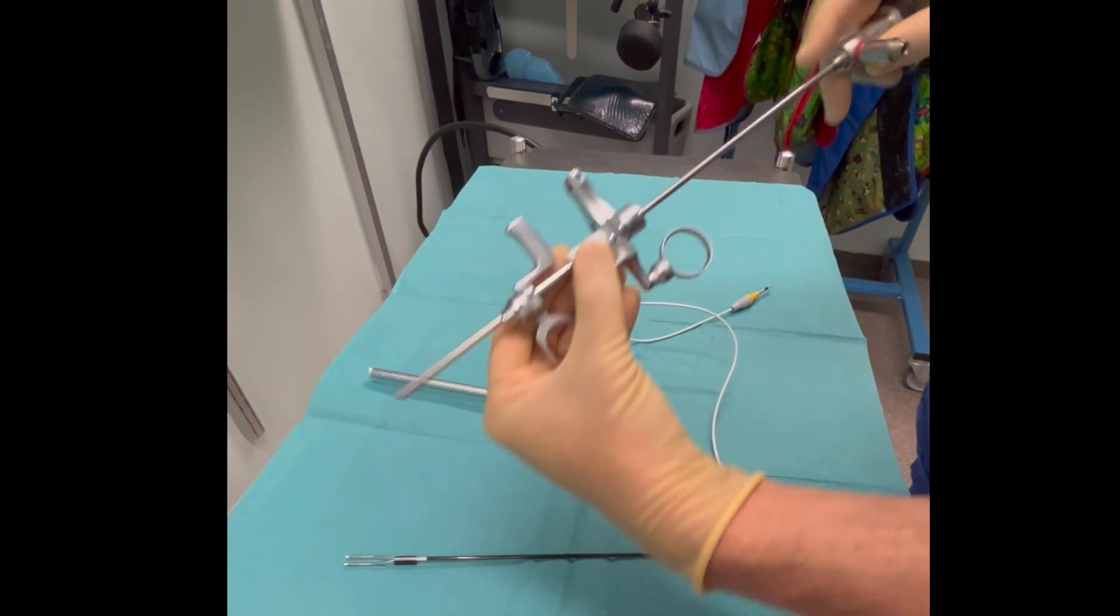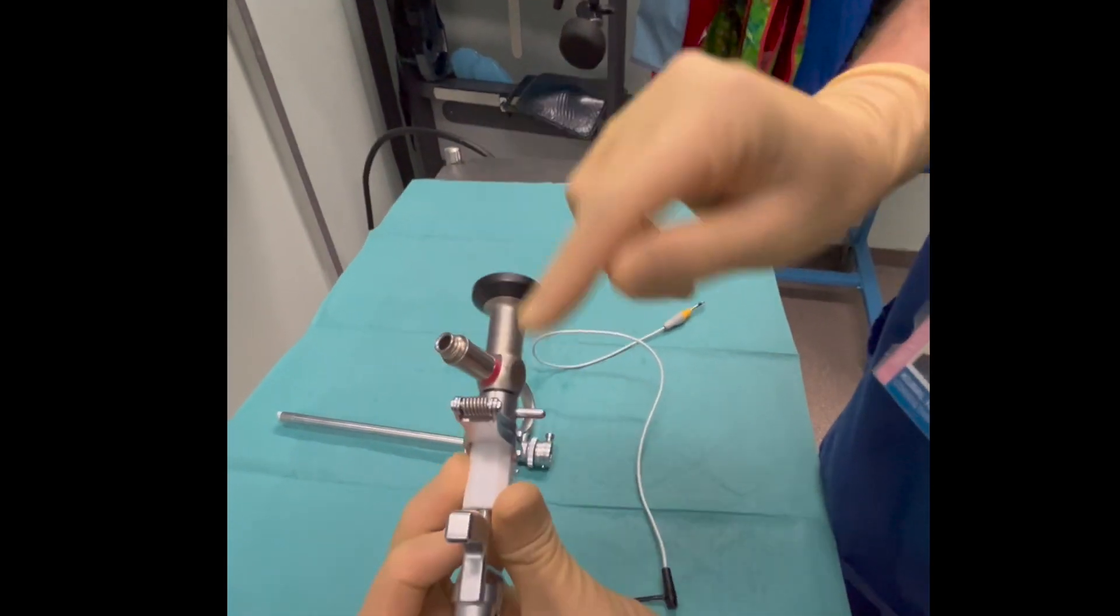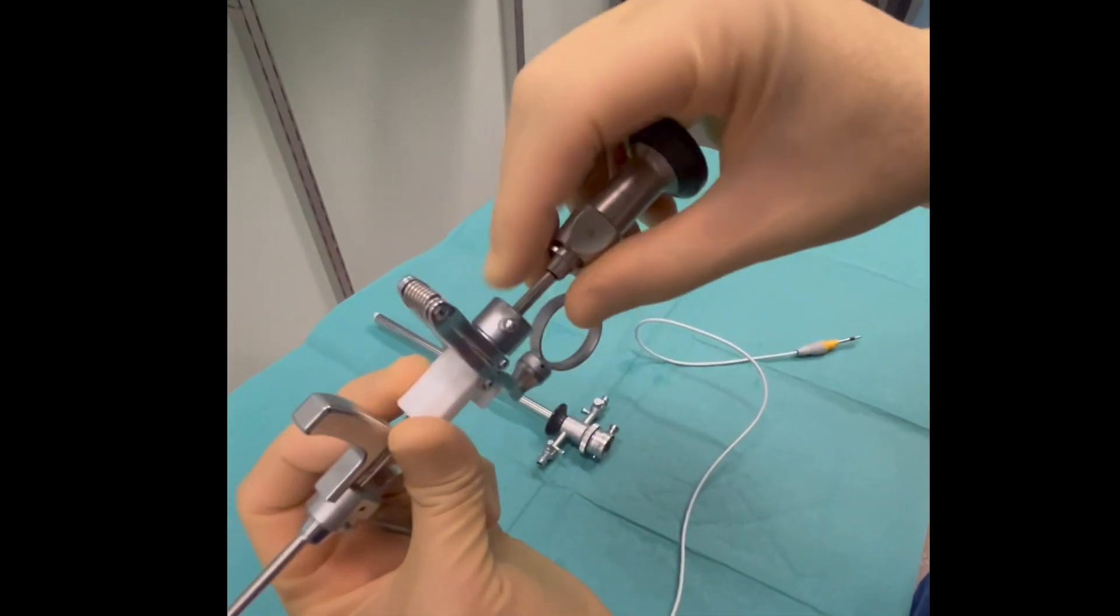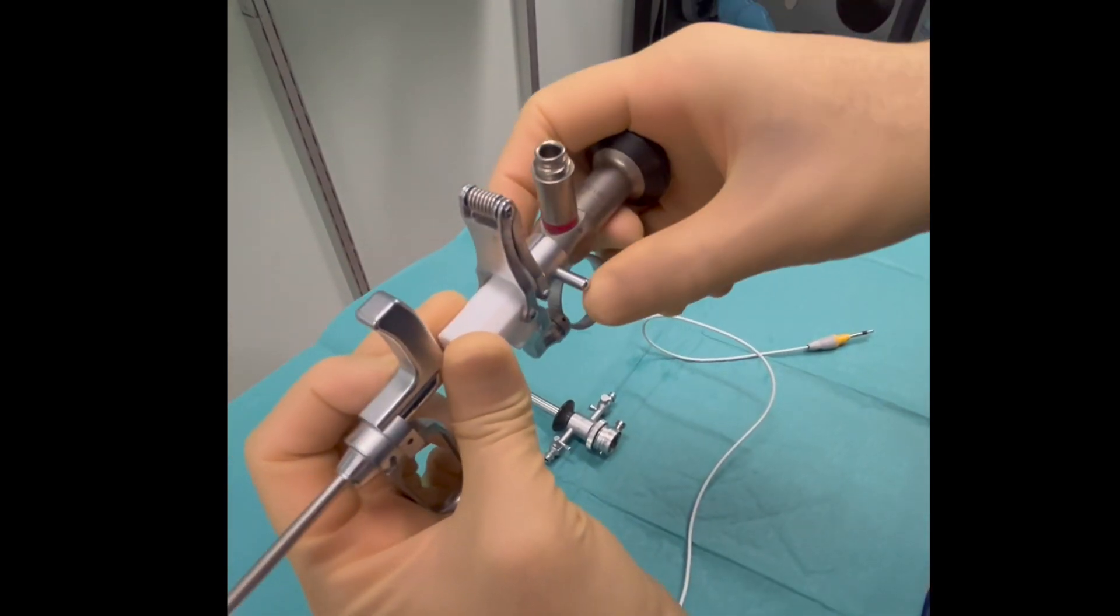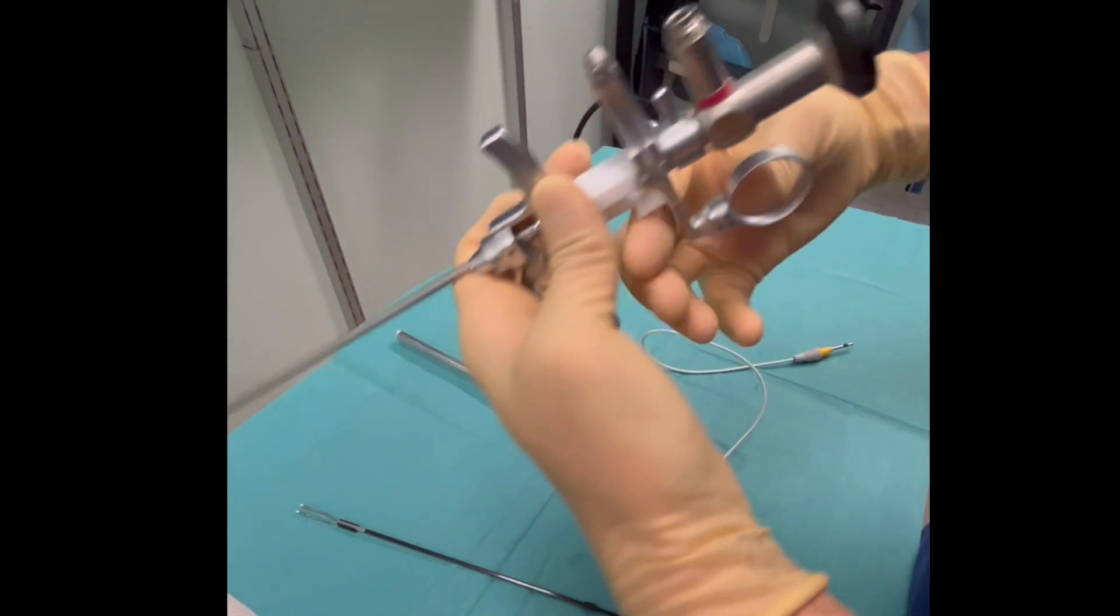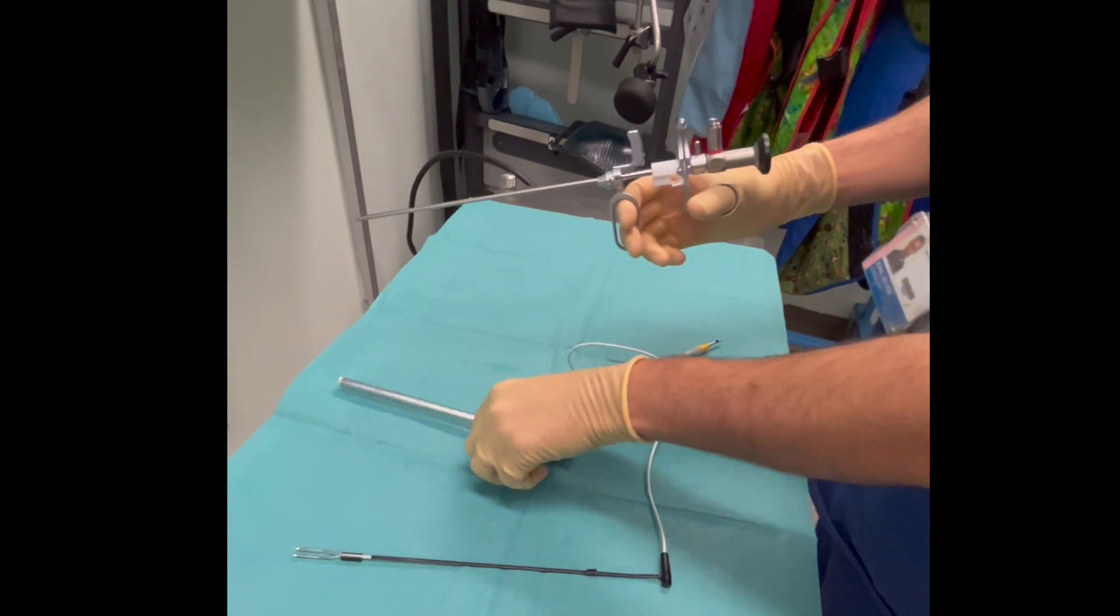This is the telescope that goes through the working channel. We look for a line on the working channel and the telescope, then we fix it. We make sure that it is tight without any loose attachments.